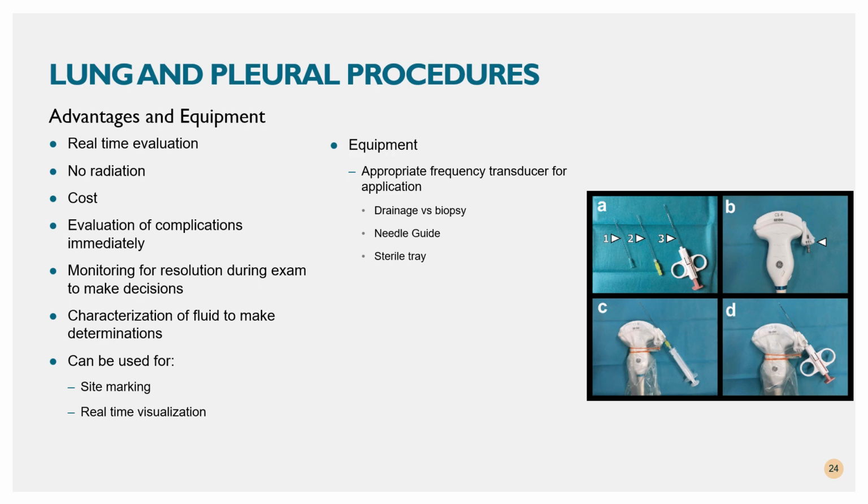So one of the great uses of ultrasound is for needle guidance. It allows for real-time evaluation of needle placement. It's cheap, it has no radiation, and it allows for evaluation of complications immediately. One of the best things about ultrasound is our ability to evaluate vascularity in real time with little need for invasive procedures. So in that respect, we really have a leg up on CT.